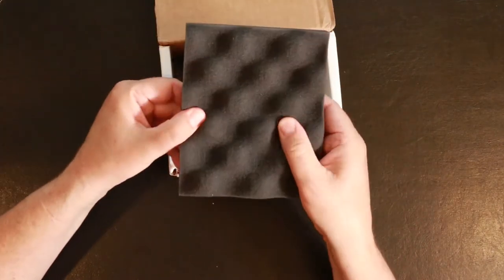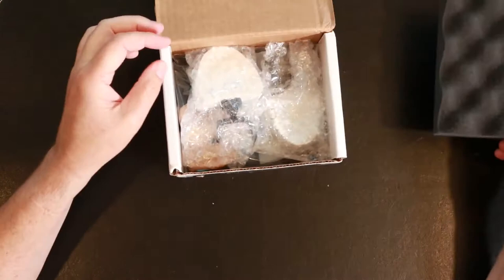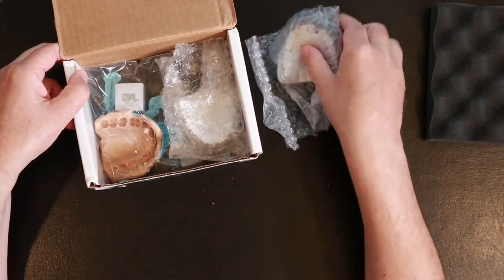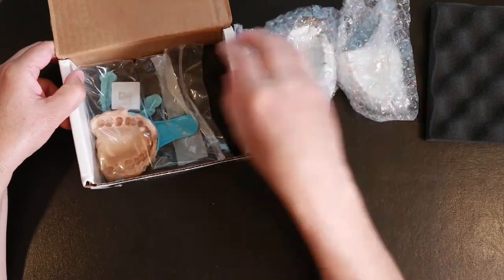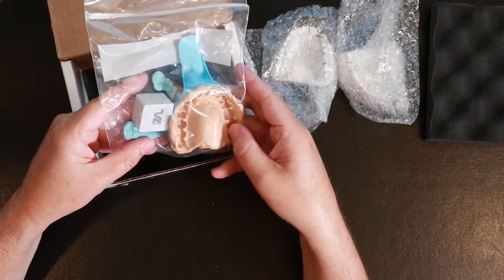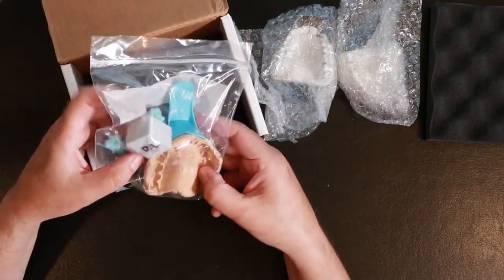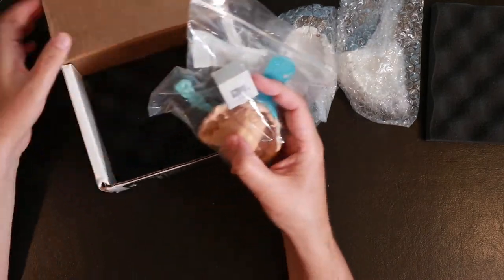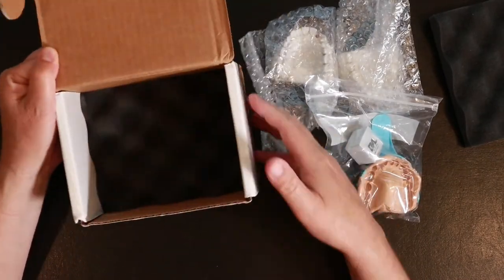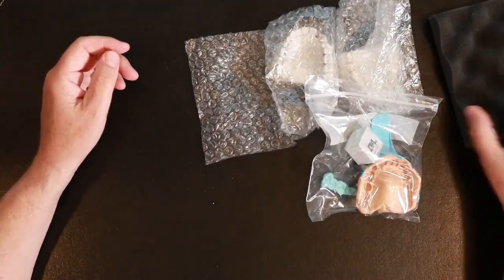It's got some styrofoam egg crate type of packaging. Inside we've got the models wrapped in bubble wrap, and then a bag containing the upper impression that I took and the bite registration and a little box that holds the bridge. And then just more egg crate foam on the bottom of the box. Let me put the box off to the side.